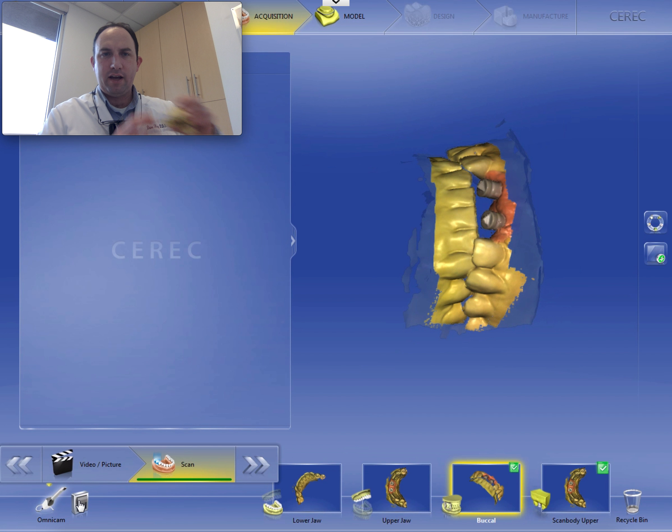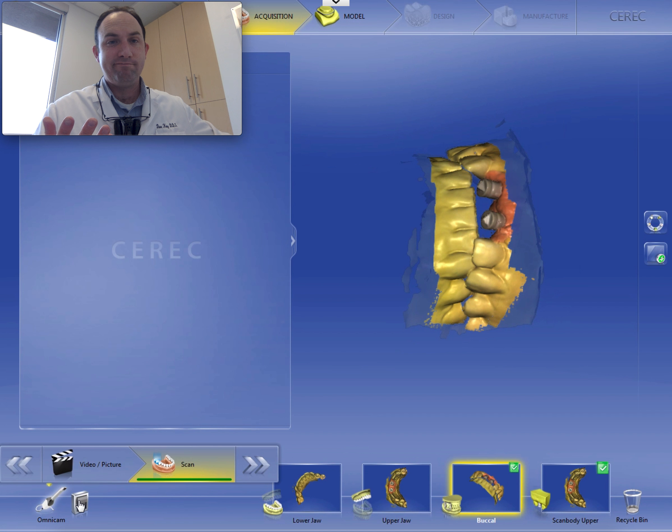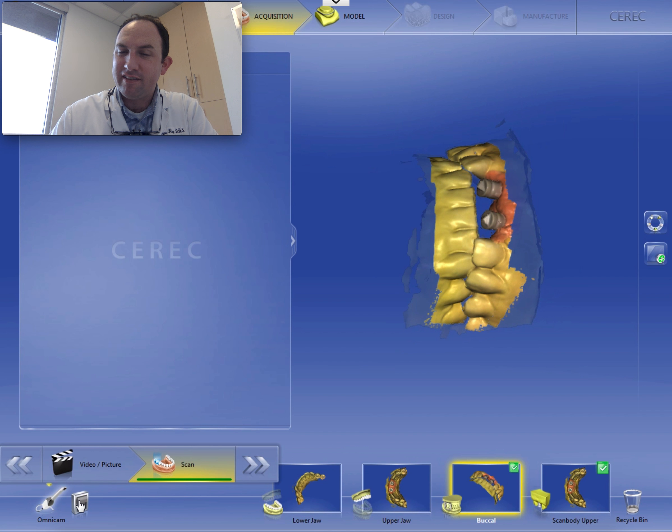Now you'll notice that scanning — granted these are models — took about five minutes, maybe? In the mouth it should take the same. If you're spending too much time scanning, you're spending too much of your computer memory. It's going to make it more difficult for you to save cases, multiple cases down the road. And it's also going to take a lot longer to design.